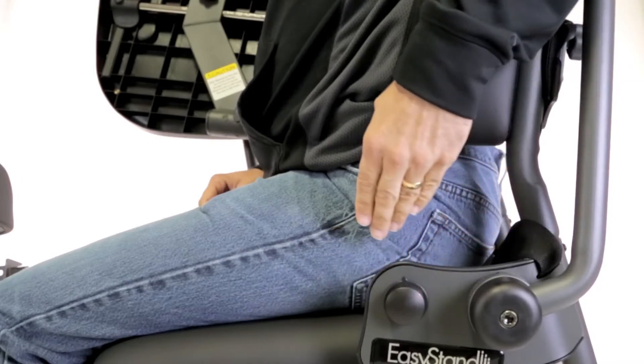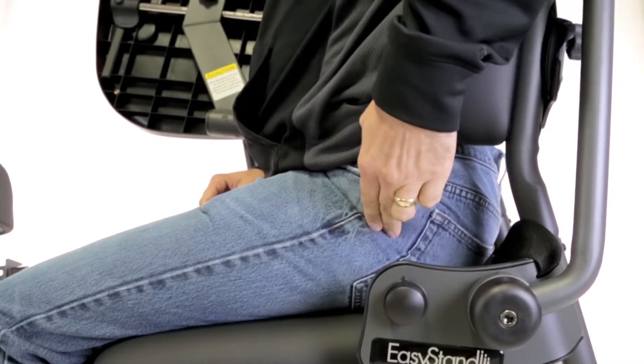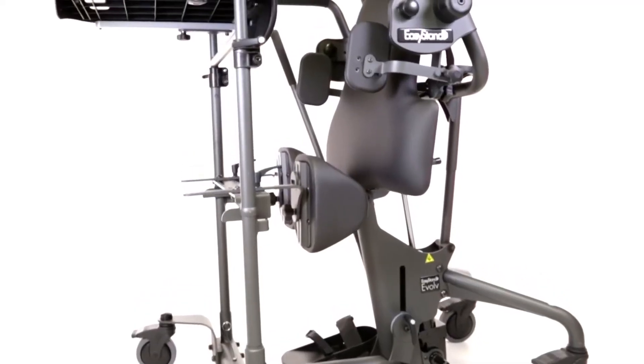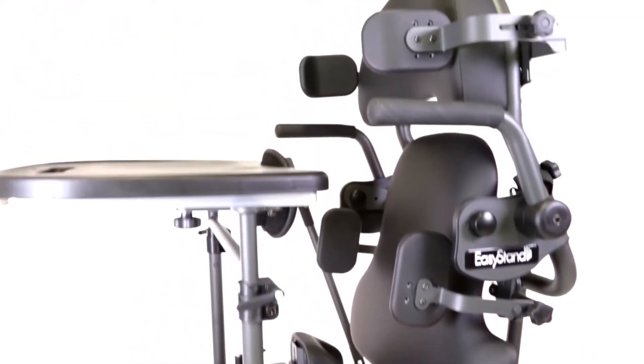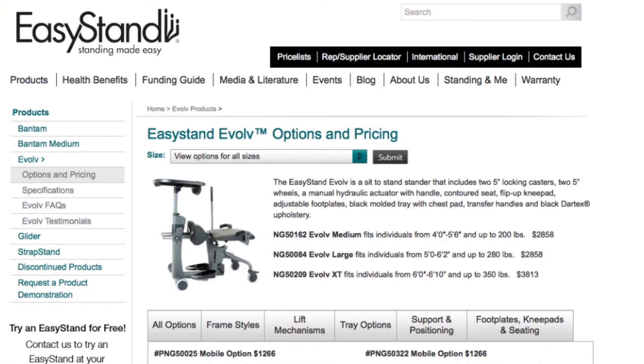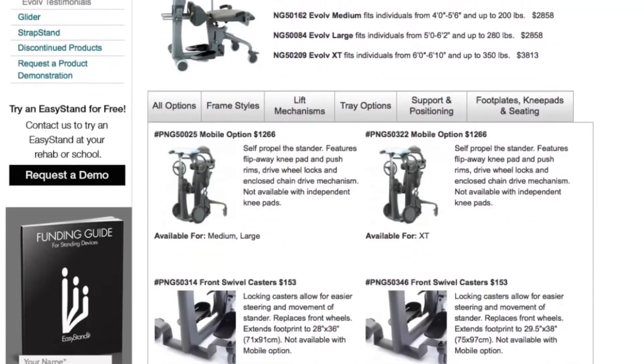By strategically placing the pivot points of the stander in line with the body's natural pivot points, options like the hip supports, laterals, and head support remain in place from sitting to standing, minimizing shear.